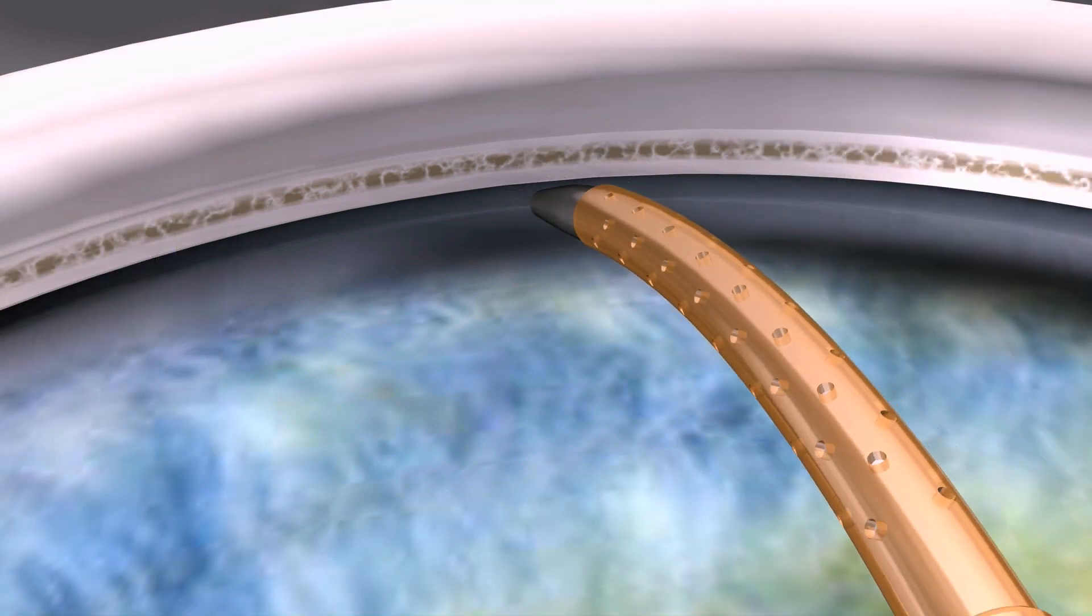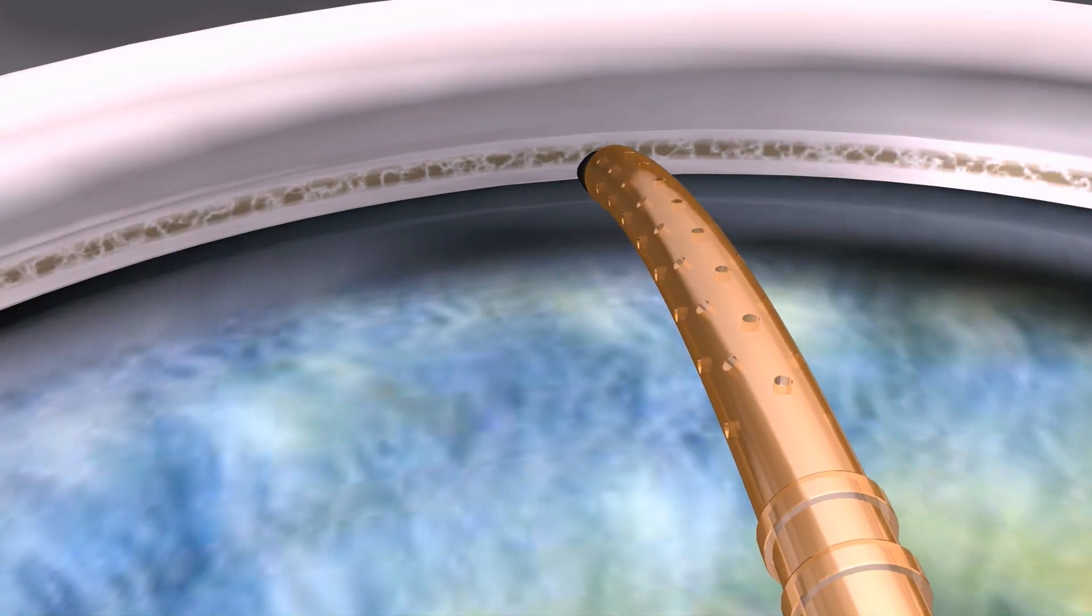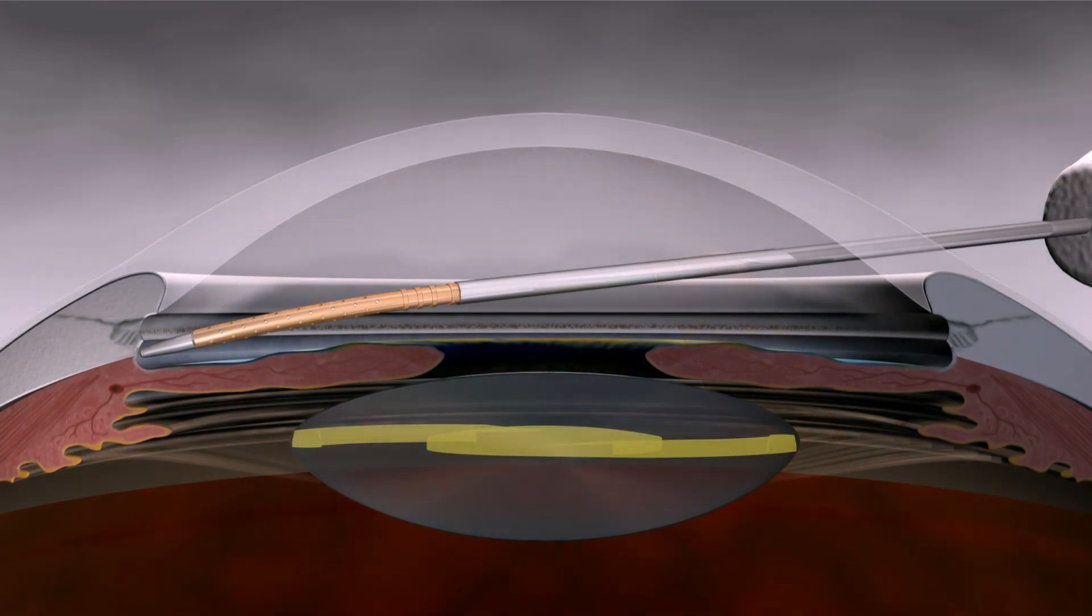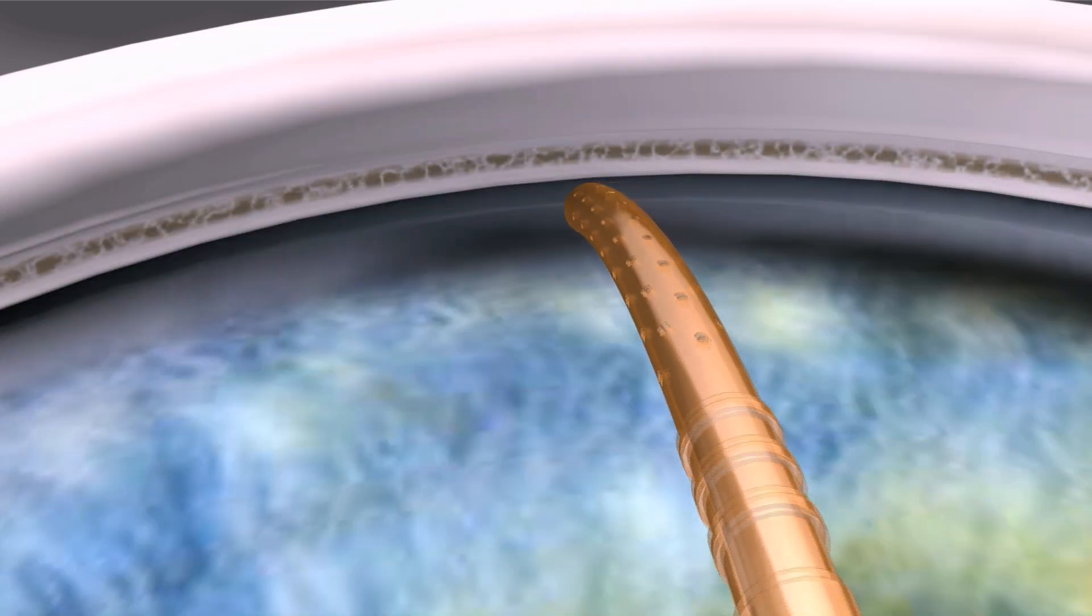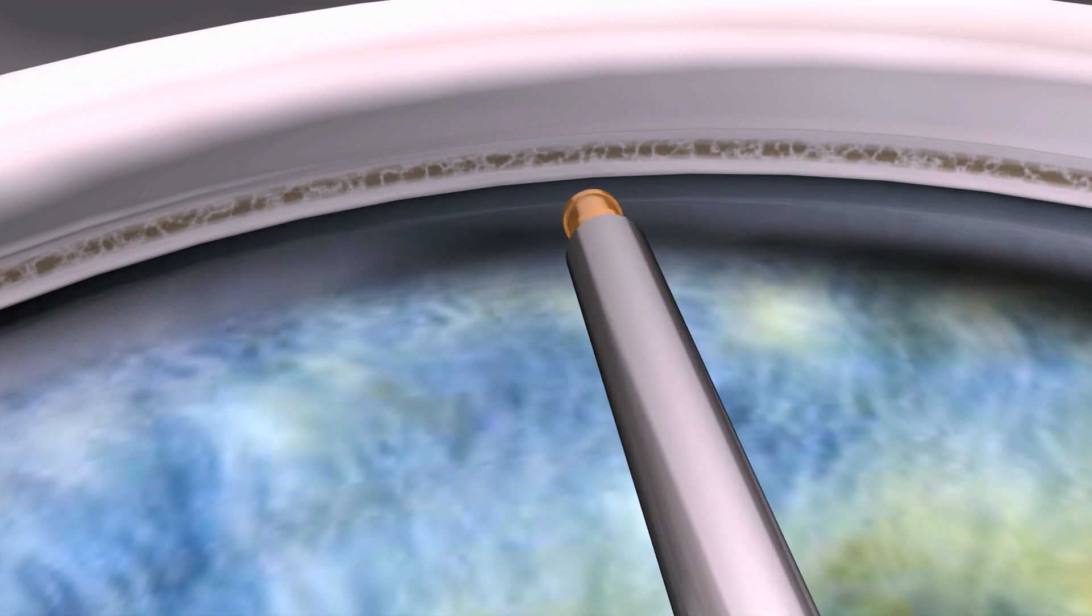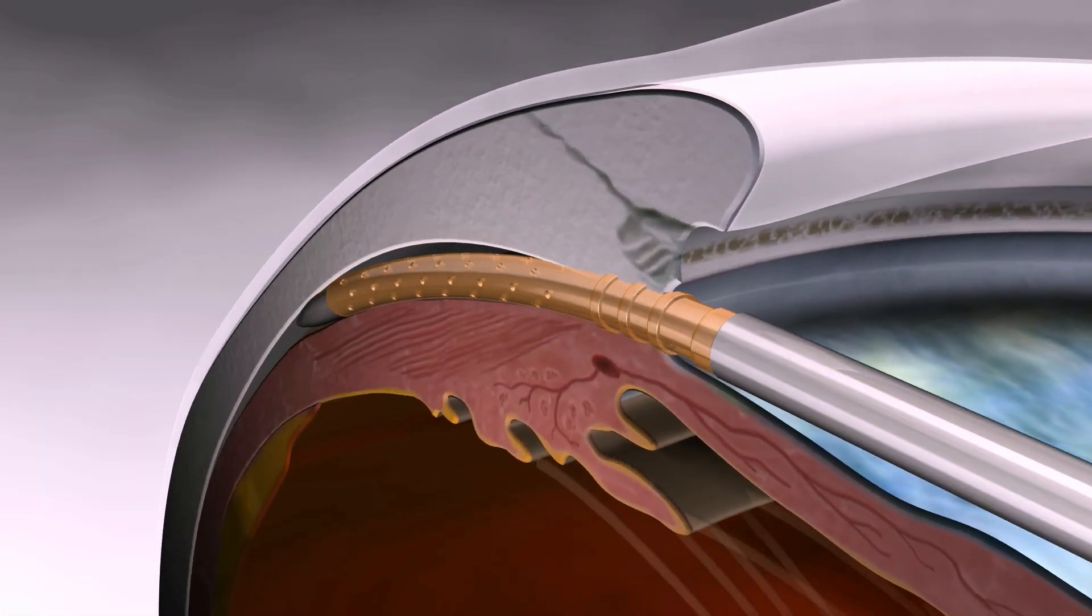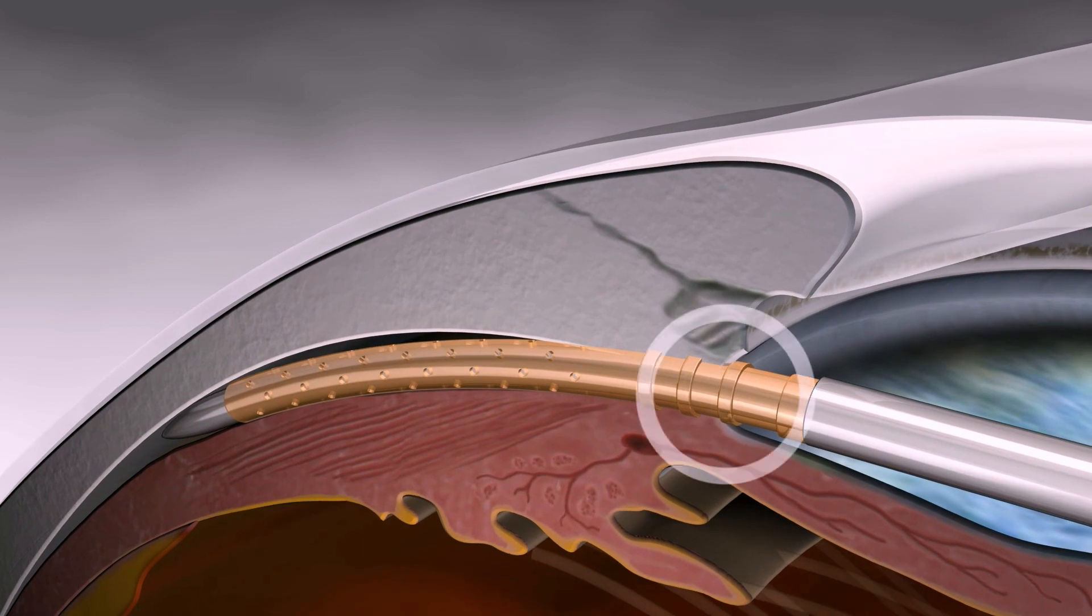The guide wire, which is shaped to match the curvature of the supraciliary space, is positioned toward the angle and introduced just posterior to the sclerospur at the iris root. The atraumatic bevel tip creates a small tissue separation between the ciliary body and the adjacent sclera through which the guide wire is advanced until only the most proximal retention ring and collar are located in the anterior chamber.